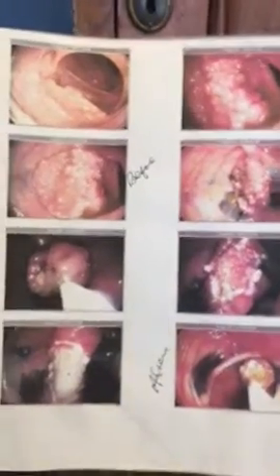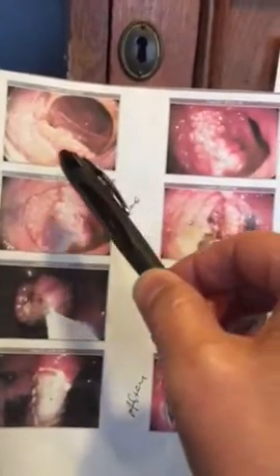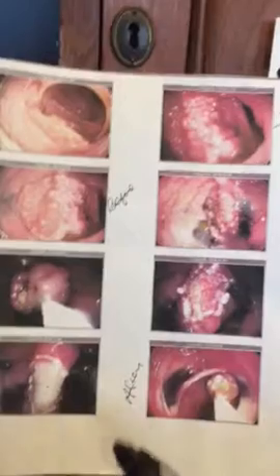This picture represents the inside of a colon at the ileocecal valve. This area right here is the ileocecal valve, and this is the tumor right here. And this is another example of the tumor as it invades into the small intestine.